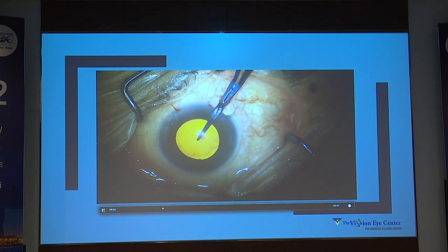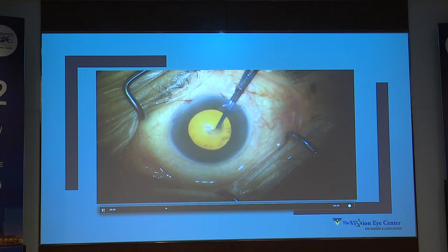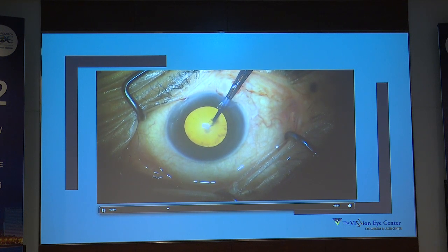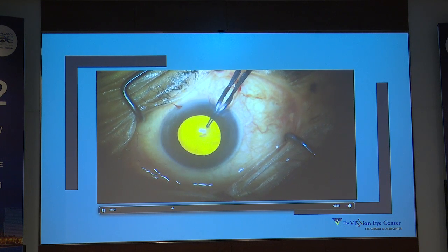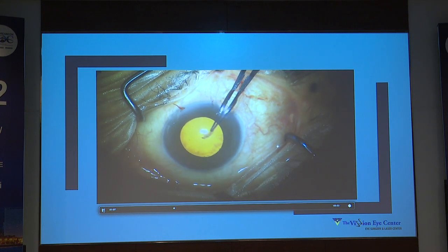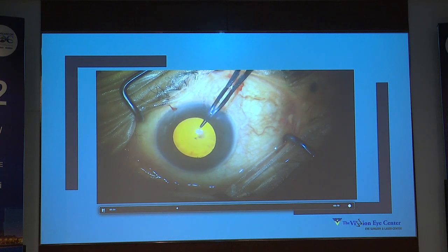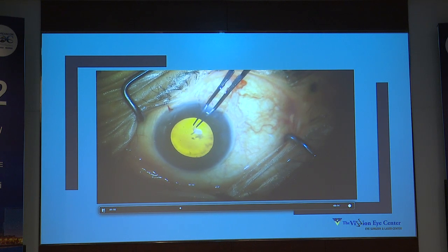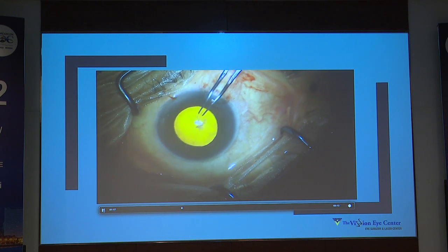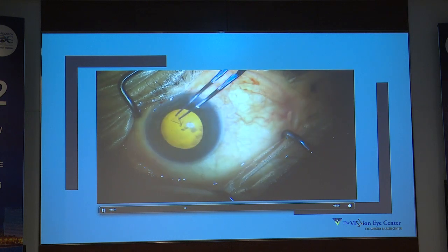So I change my position, I change my wrist position, I change my finger position. I'm a left-handed surgeon, so my things might be opposite for you. I'm a rhexis person, not a needle. Again, finding it difficult because there is not much access that I had. This is where things can go haywire and my rhexis runs away, I can be in trouble. So I'm going very, very slowly.